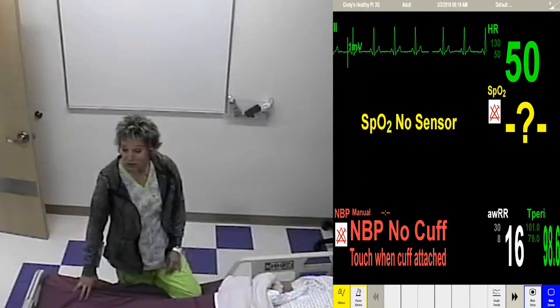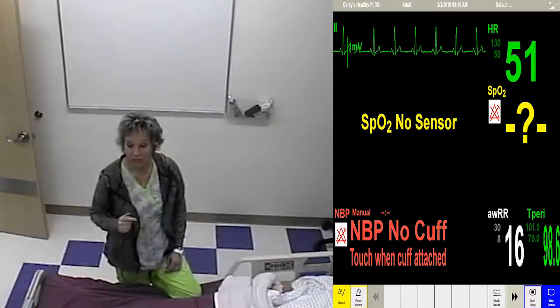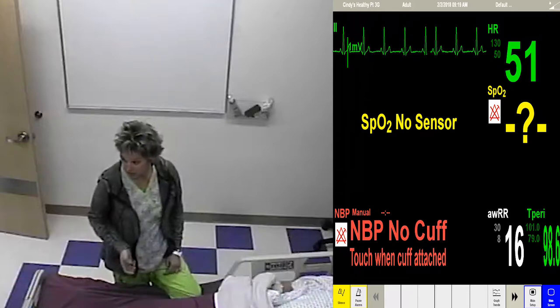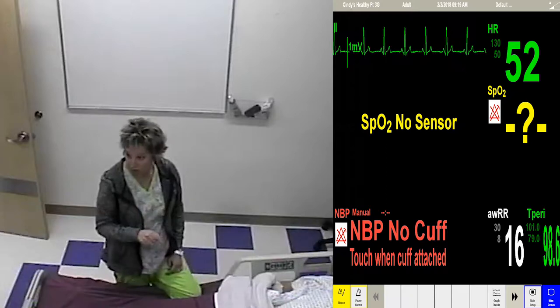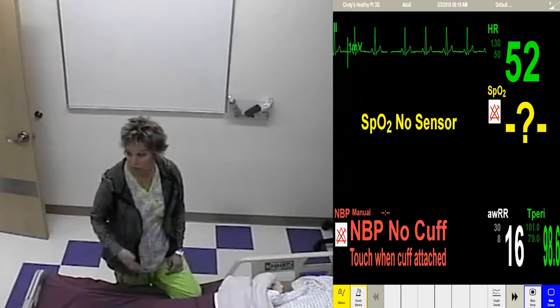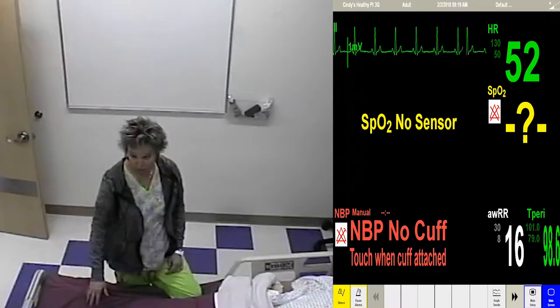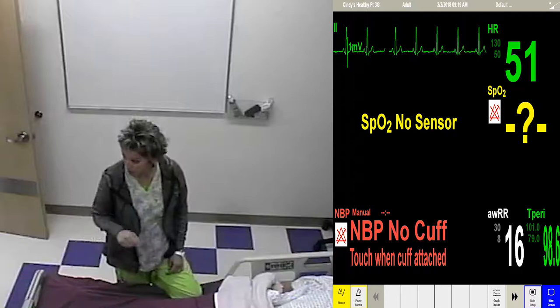So you answered yes to every question. So this rhythm is? Sinus. A normal heart rate is? 60 to 100. This one is too slow. So our nursing word for too slow of a heartbeat is bradycardia.